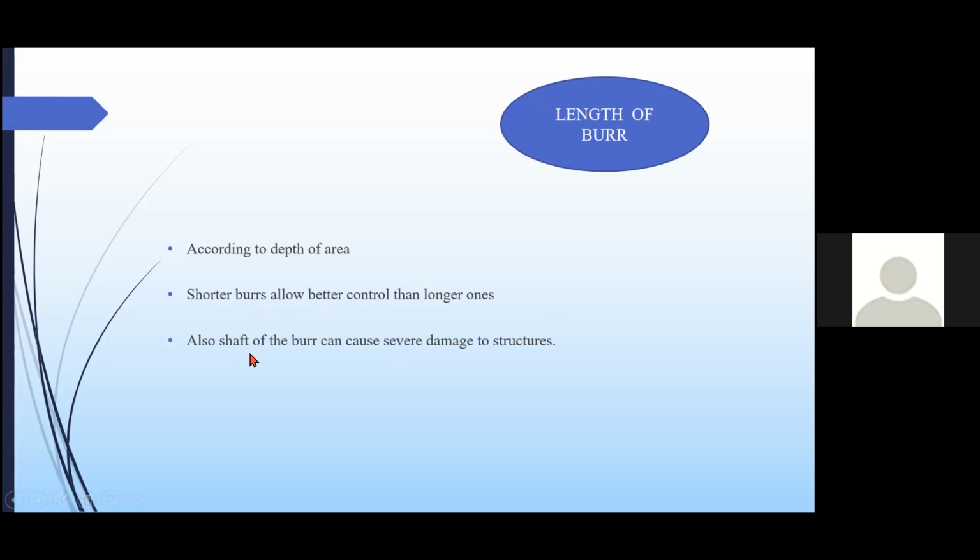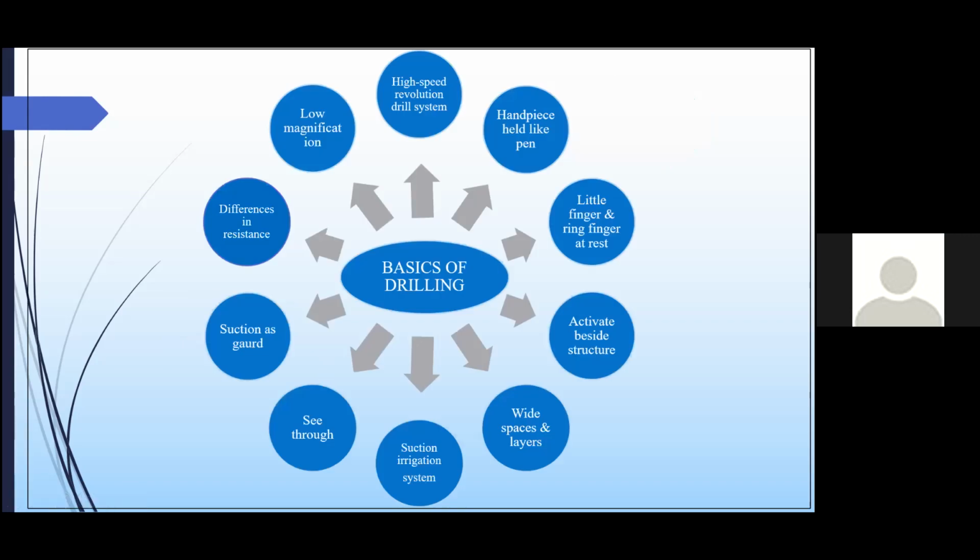And the shaft, even though we always take care of the tip of the burr, can also catch hold of connective tissue or skin of the area, or delicate structures, and can cause severe damage. So the length of the burr should be considered whenever we are planning on drilling any part of the mastoid. So let's start the basics of drilling.